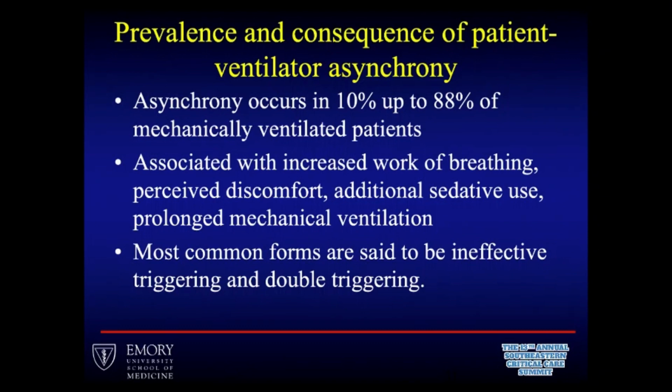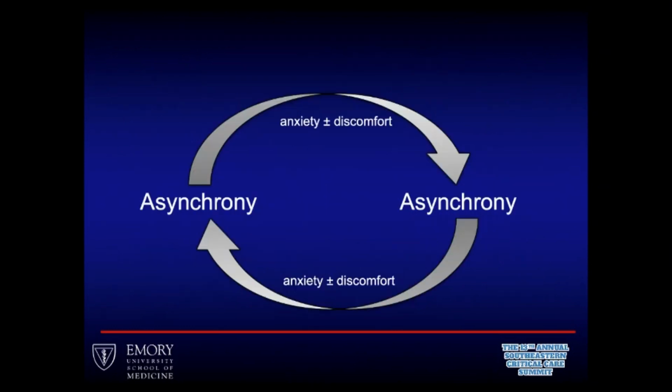Dissynchrony or asynchrony is associated with an increased work of breathing for the patient, perceived discomfort or anxiety, potentially actual discomfort and anxiety, but especially perceived discomfort and anxiety. Additional sedative use by the healthcare team, and prolongation of the mechanical ventilation time. The most common forms are ineffective triggering and breath stacking.